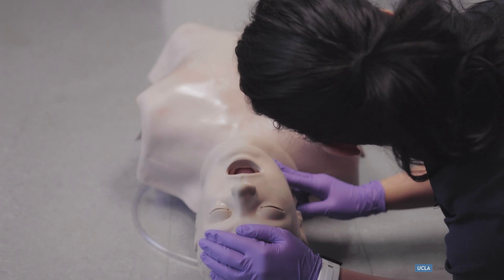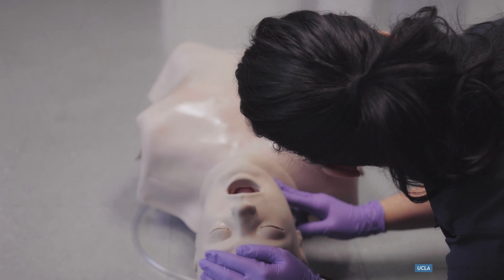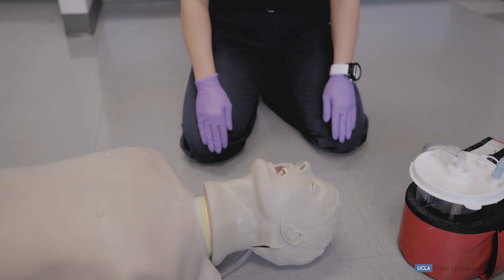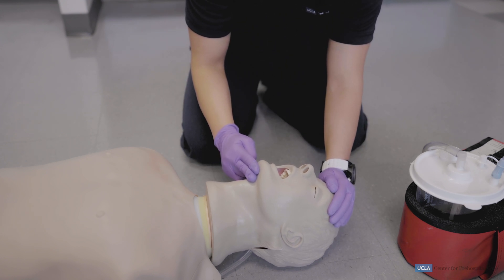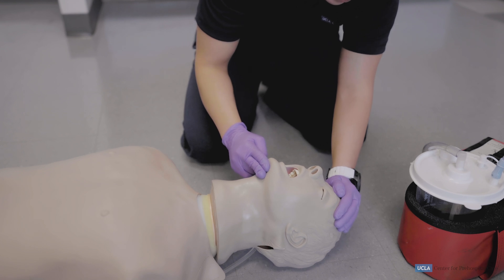To observe breathing, look down the plane of the chest, looking for chest rise and fall. Use the head tilt, chin lift maneuver by placing one hand on the forehead, two fingers below the chin, tilting the head back and opening the airway.